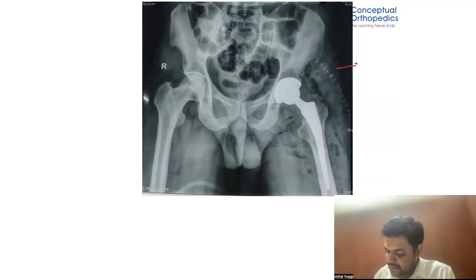After reducing to a certain degree of hip flexion or extension, this hip is getting dislocated. Component stability is good, component versions are very good, but this hip is getting dislocated. You can see a well-placed cup, well-placed stem, version is right. The only thing that can explain this is the offset — it may appear subtle, but this is what gives you instability. Ultimately, it is the offset that provides stability.